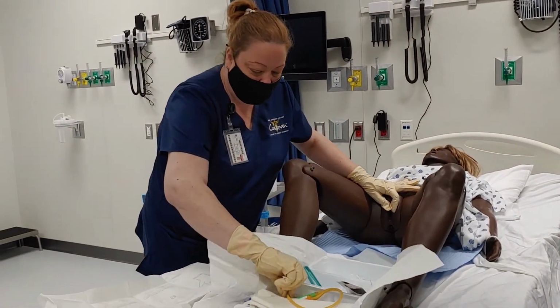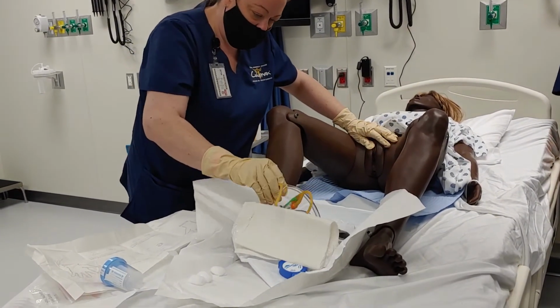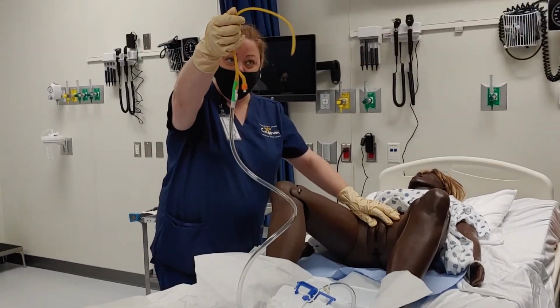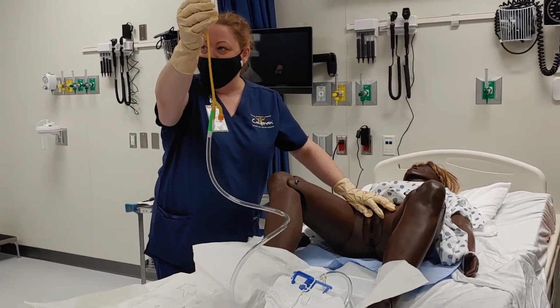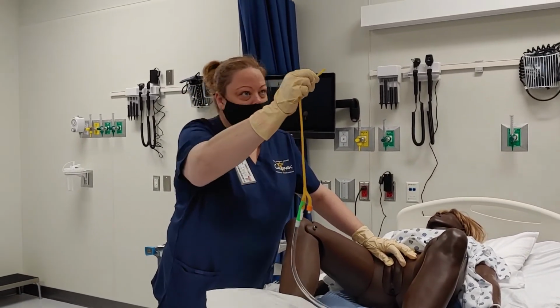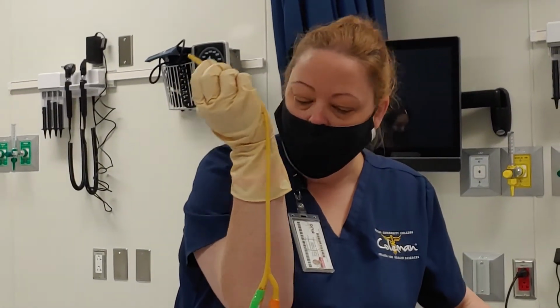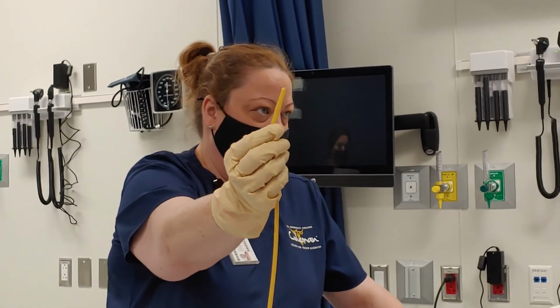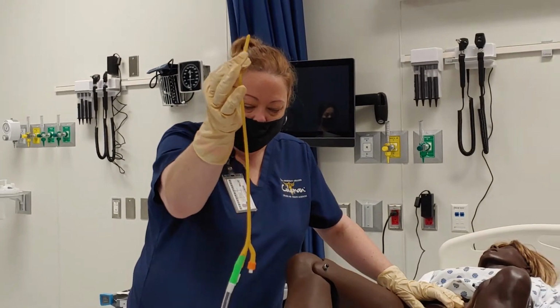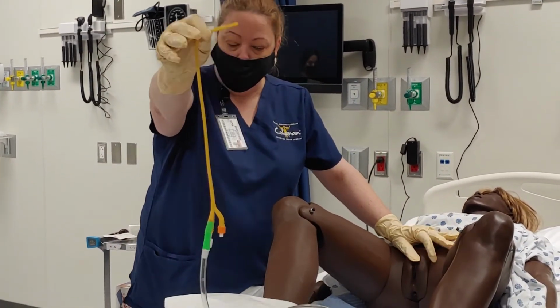Once I have done that, I'm going to take my catheter. Okay, remembering that this part must stay sterile. This is the part that's going to be inside. This part must stay sterile. I'm going to hold it up here close to the tip. Does everybody see that little opening there? Yeah. Can you see that? Mm-hmm. Okay. So that little opening, there's a point to it. That's how the urine gets in. So this has to stay sterile. Remember, my right hand is sterile. My left hand is dirty because my left hand is holding.